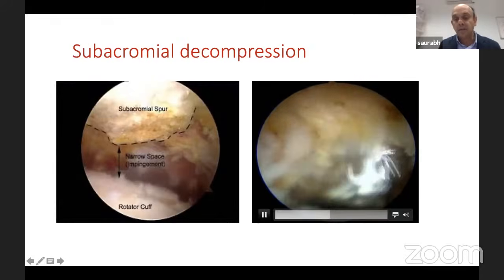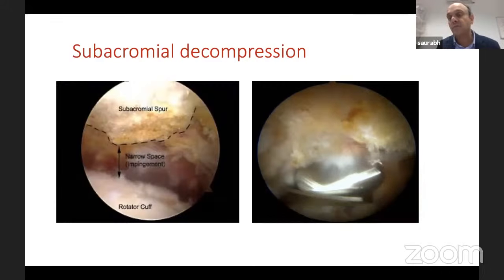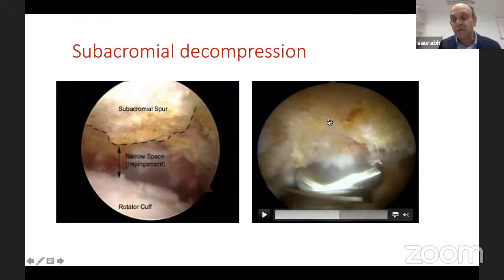Now a little tip here is, because this was a very gentle curved acromion, I have just generally shaved it because I was making videos as well. Otherwise, a tip is you start on the lateral edge, anterolateral edge. You calculate how much acromion you want to take off, depending on the size of acromion. You make that much divot here, and then, once you know you made a divot of 8 millimeters, you just need to extend that through the entirety.